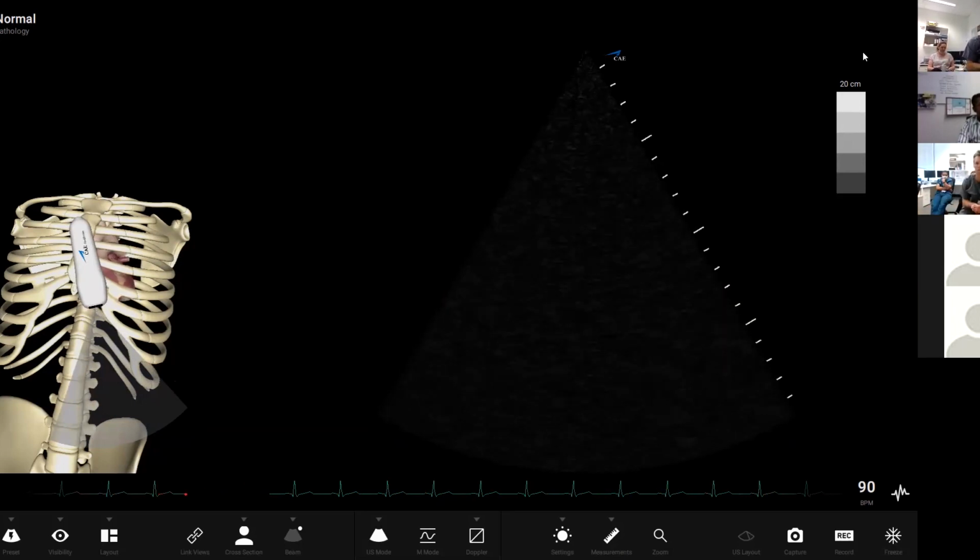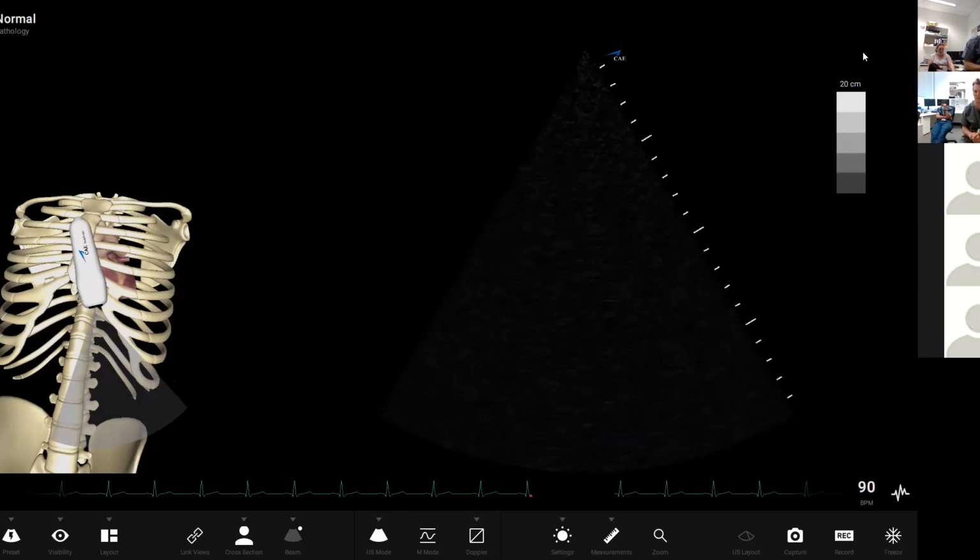Okay, so for this week's DDU teaching, I was hoping to take you through how to image the critically ill patient with transthoracic echo. It's a really common question in the DDU. Previous examples have included, describe how to analyze left ventricle systolic function in a difficult to image critically ill patient. But I'd like to take a broader approach, because I think other questions would also be along the lines of how to get decent Doppler angles or analyze aortic stenosis in a difficult to image critically ill patient and things like that.